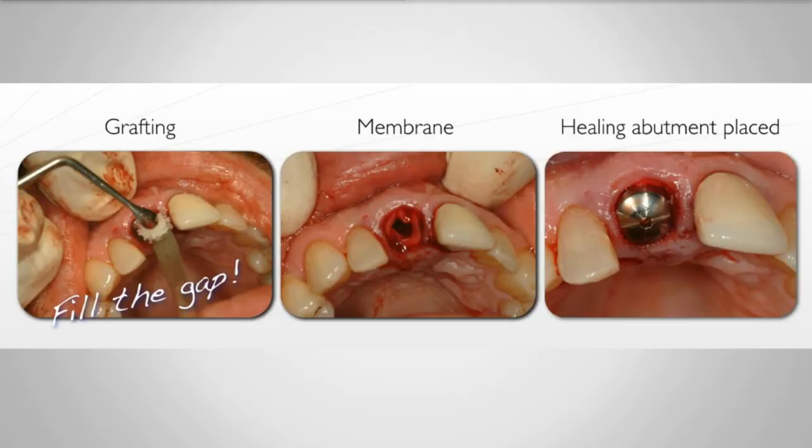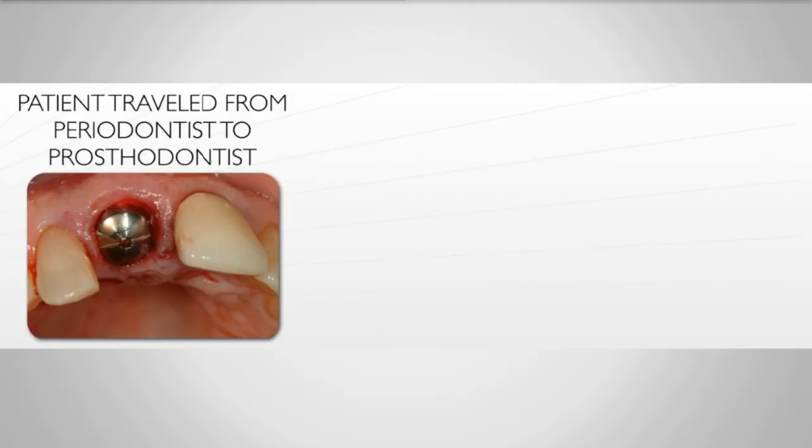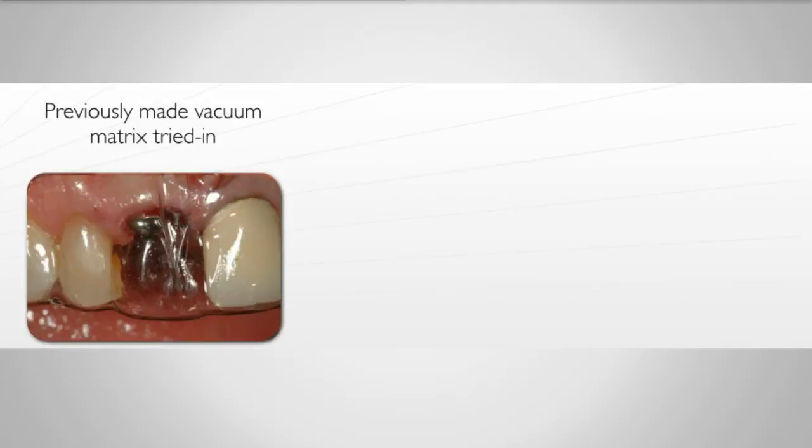The surgeons that I use typically will use Marcaine or a long-lasting anesthetic. That way the patient does not have to be re-anesthetized when they come to my office. I had previously made an impression of Frank's teeth, and from that impression I made a clear matrix, what you might call a vacuum suck down. And that's what I'm going to use to make this provisional restoration.